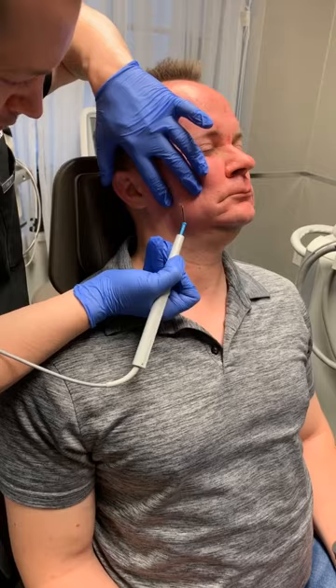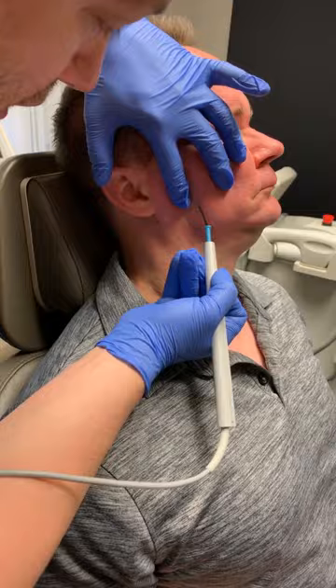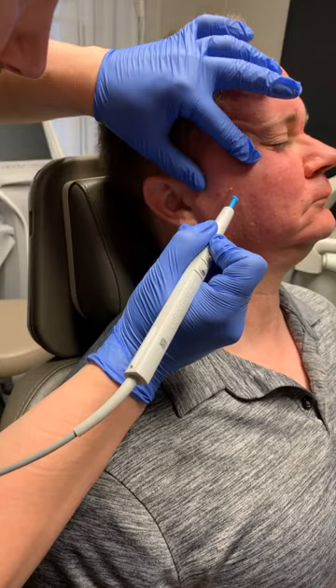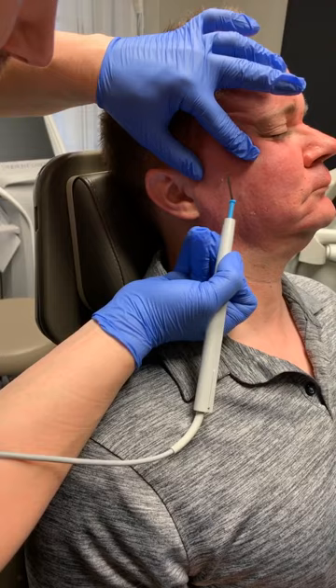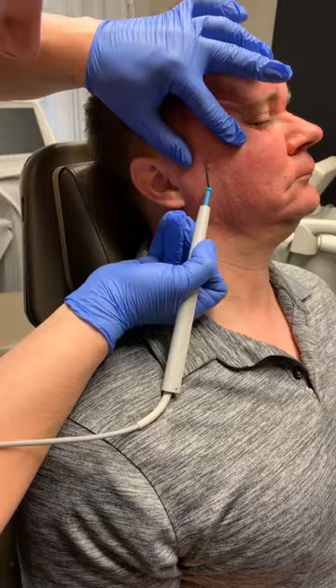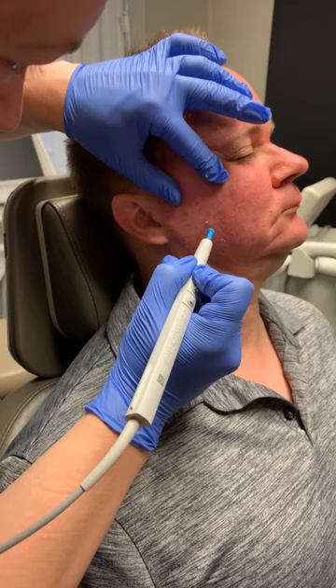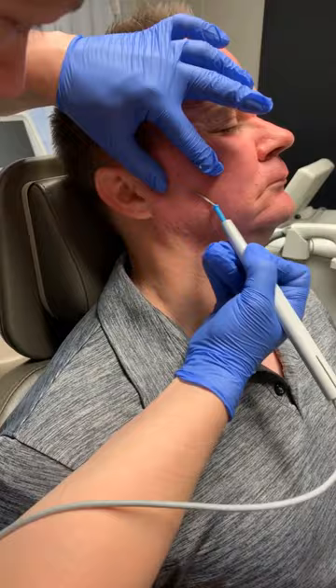What he's trying to do is kind of just shave those off the surface. The base of that is here, so there you get the base. You don't want it too aggressive or it'll grow back. He's got a lot of them all over here — he's going to lightly tap these. You're going to see them all coming off. It's like doing a little work on the surface. You're going to have a really nice, fresh result.